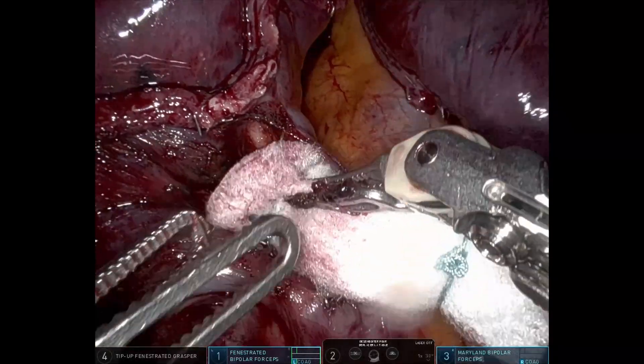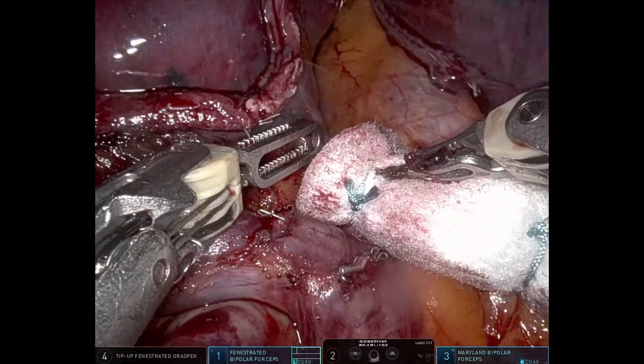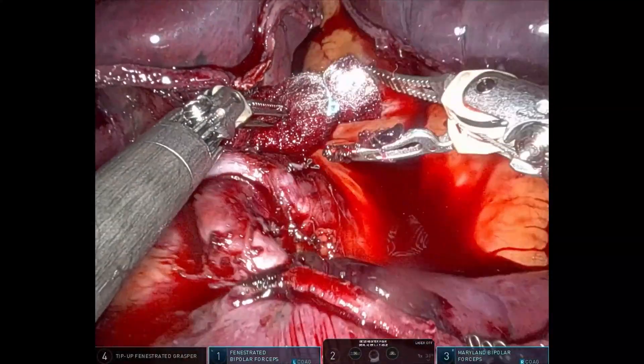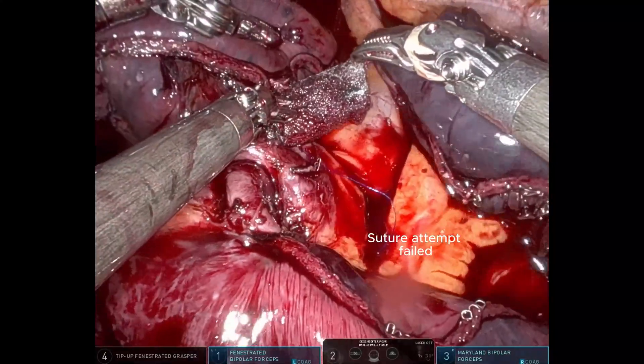In this second case, while attempting to cauterize a minor bleeding point on the pulmonary vein, the lesion worsens, resulting in increased venous bleeding. The suturing attempt was unsuccessful.